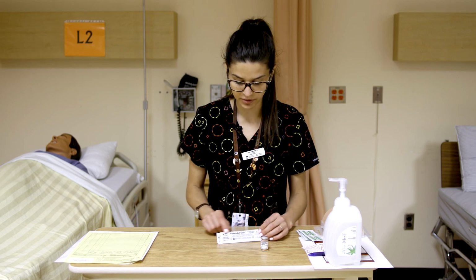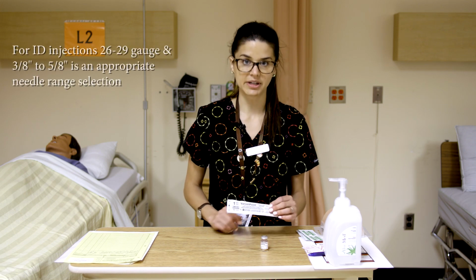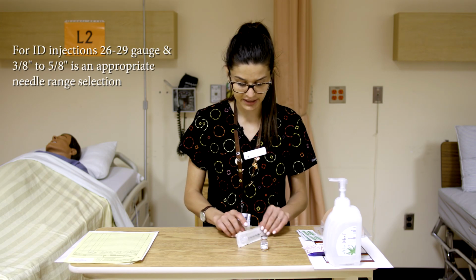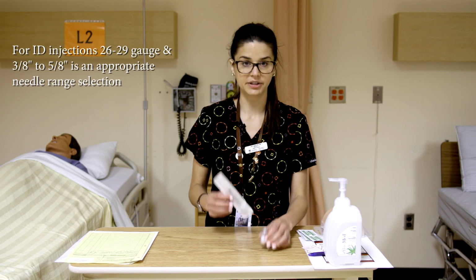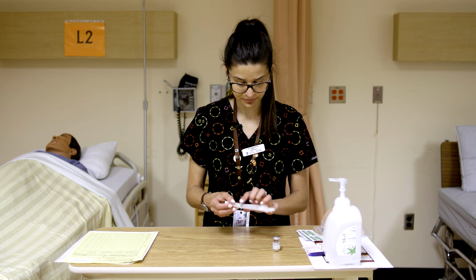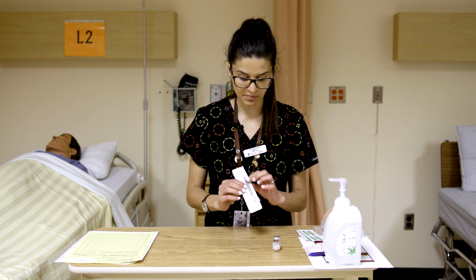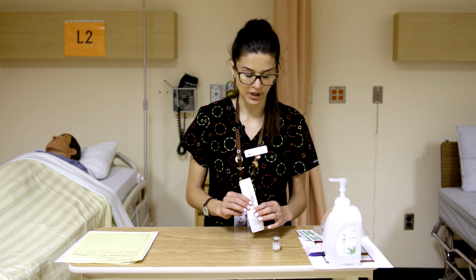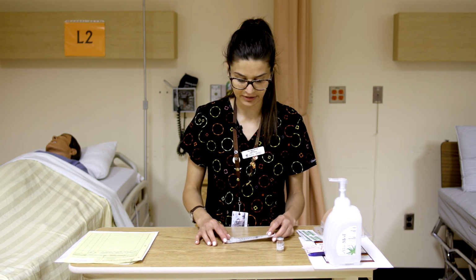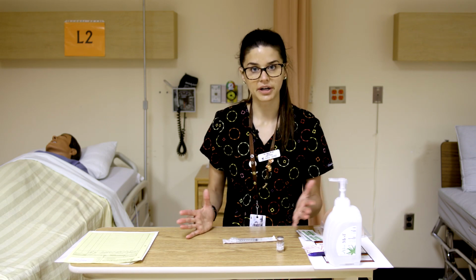So you do get oftentimes a 1 cc vanish point tuberculin syringe. So lots of units will have this. Because it's marked in mLs and not necessarily unit specific to our Tubersol, this syringe can actually be used for, say, another intradermal type of injection, because it's just an mL. So as long as you know how much of the medication you need, it has a good sized needle on it for that.